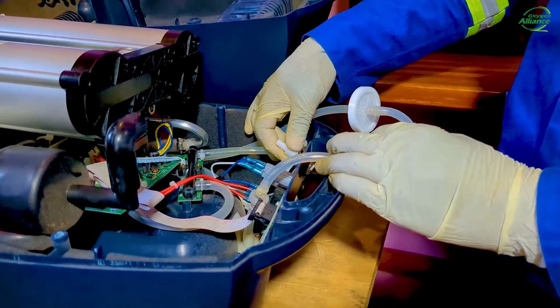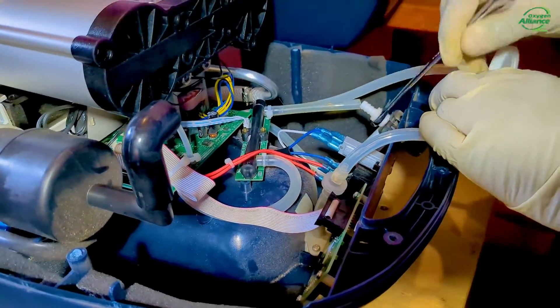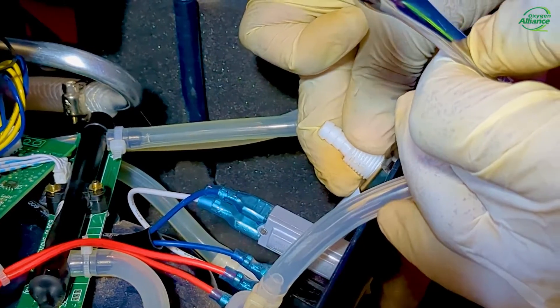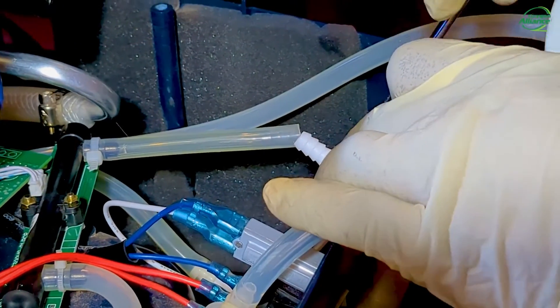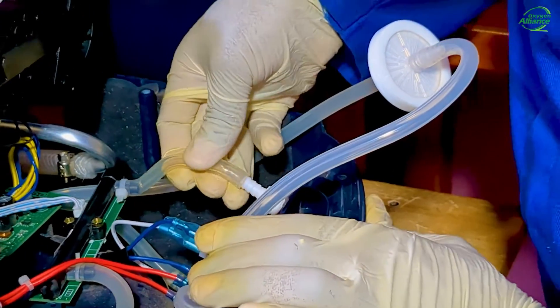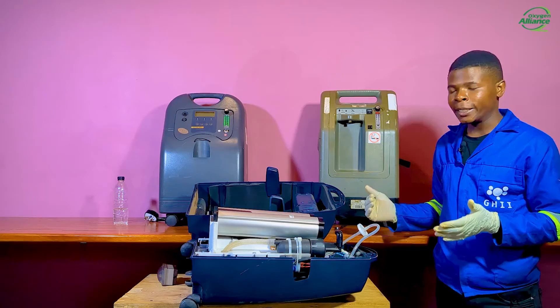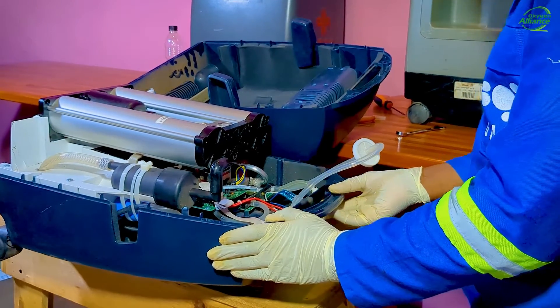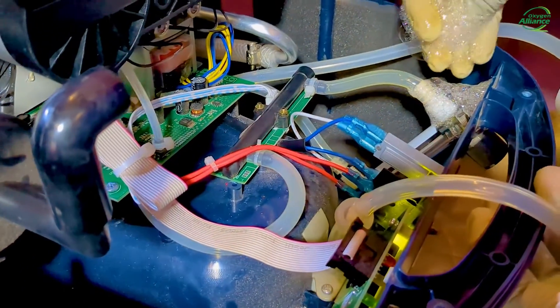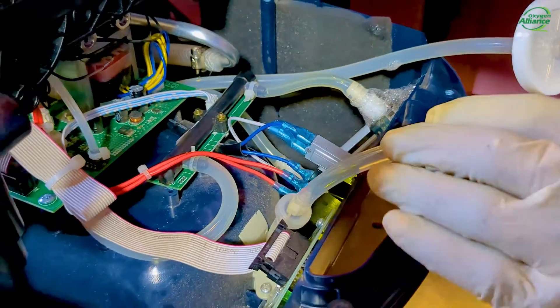I'll first switch off the oxygen concentrator and tighten this. I'll use the spanner to tighten it. Make sure you don't over-tighten it — just make sure it is firm enough, as over-tightening may end up damaging the fitting. I will now turn on the oxygen concentrator and test for leakages again. Using the soapy water foam, you can see that the bubbles are gone. I'll continue doing the leakage test on other potential leakage points.